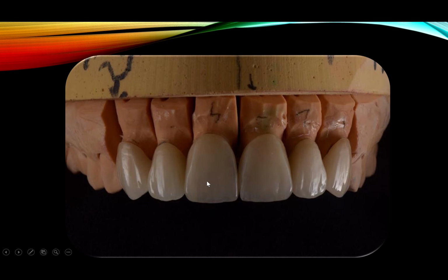I get full milled zirconia, then I do a minimum of cutback, because so far I don't use ultra translucent or super translucent zirconia yet. I use HT plus, high translucent zirconia, in the range of 4 yttrium stabilized zirconia, if you guys remember, about the range of 750 to 800 megapascal. That's what I use. So it's a bit translucent, but it's strong at the same time.